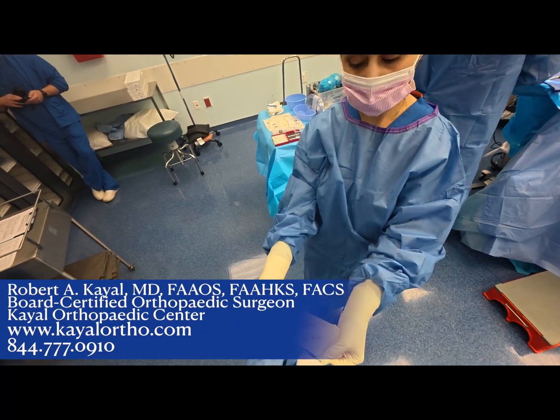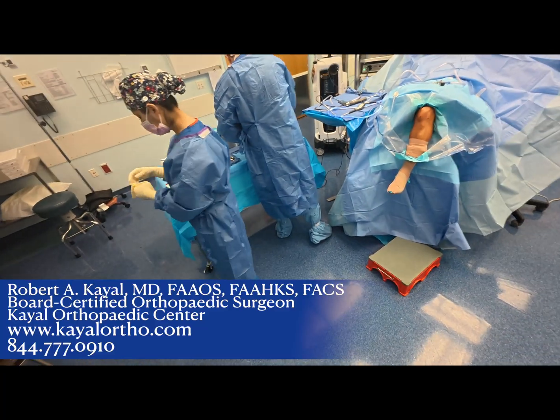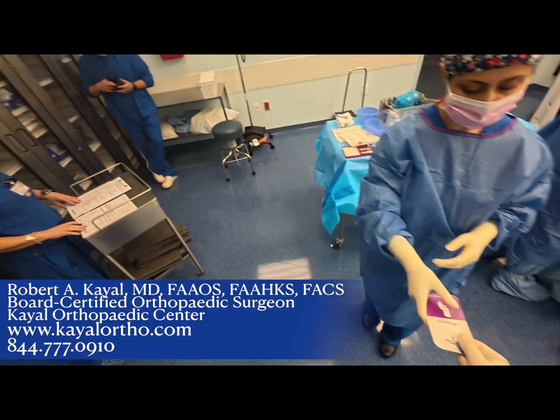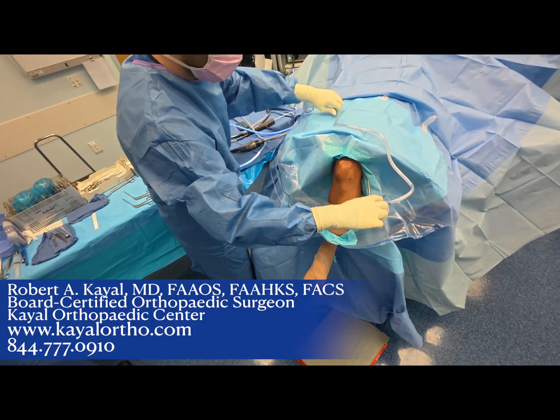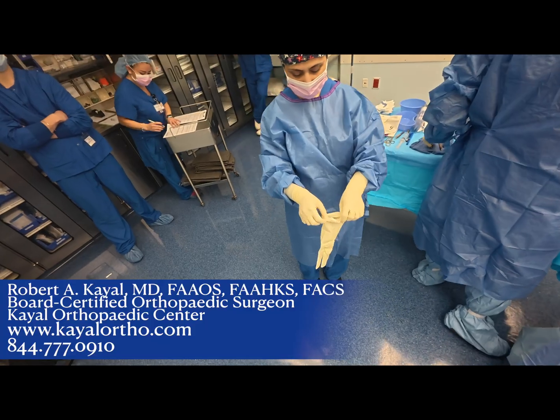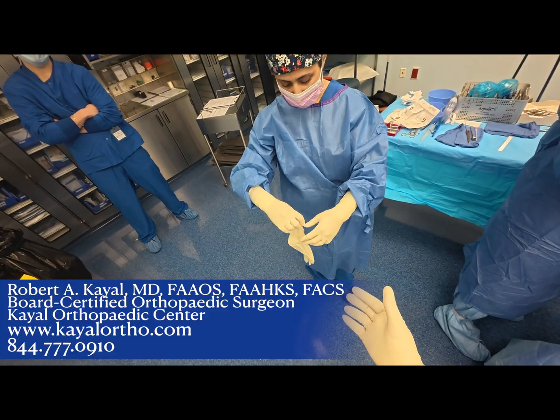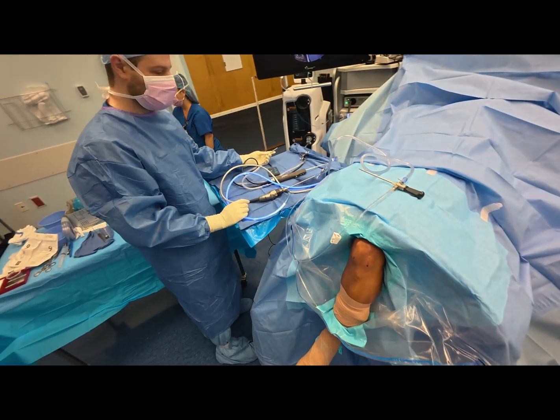So this is a left knee arthroscopy. Apparently this gentleman had a left knee arthroscopy by an outside surgeon at an outside institution about 20 years ago and has developed recurrent pain in the left knee, predominantly on the inside of the left knee. MRI was performed as equivocal for a recurrent tear of the medial meniscus. So we'll see what we're dealing with.